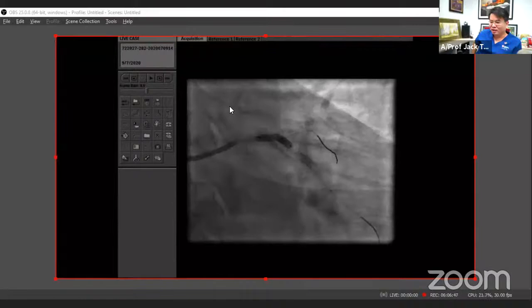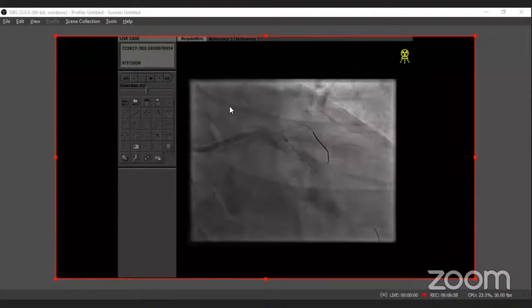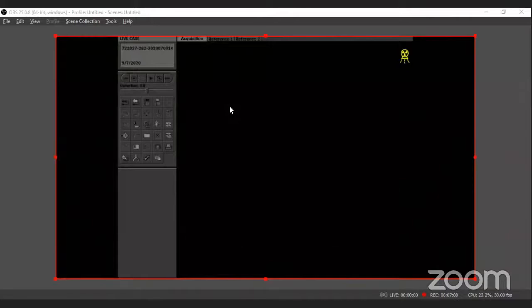Come back a little bit. So we know that we're going to stent quite far back to the left main, so we're going to do a high pressure balloon here. Careful with the guide, because there's still some trapped wire here. Okay, 14.